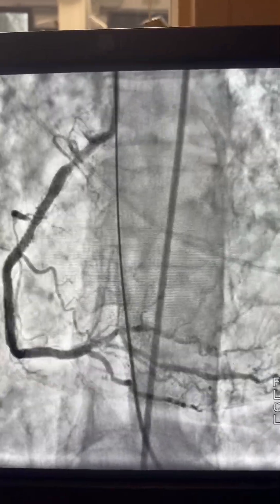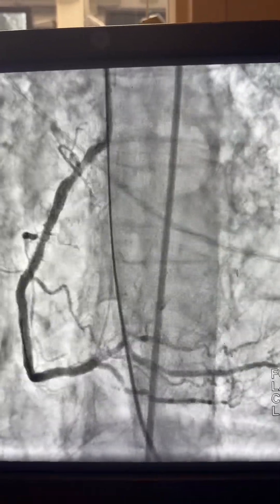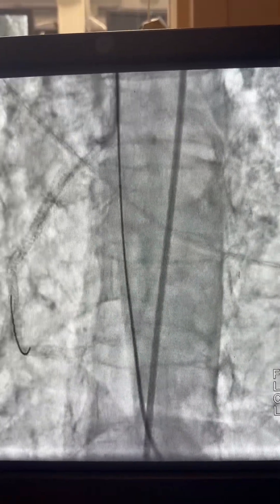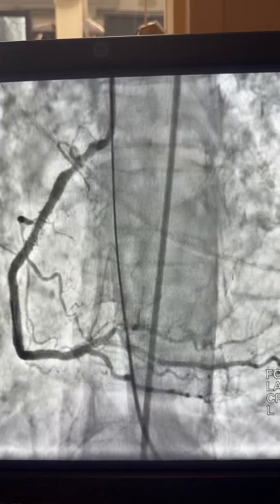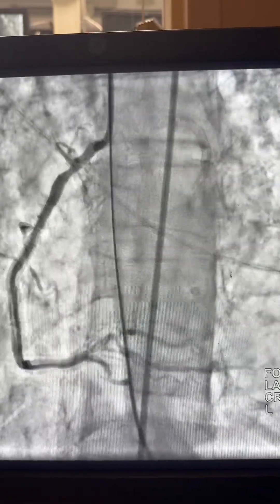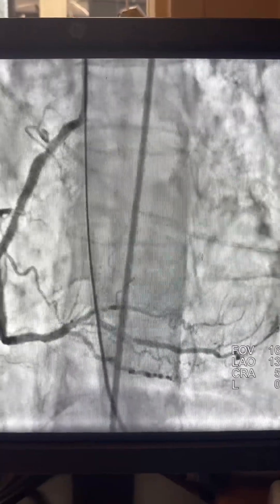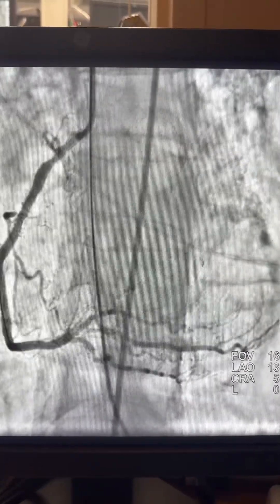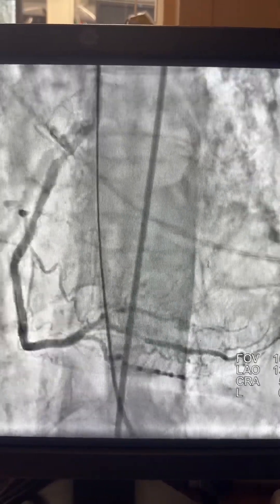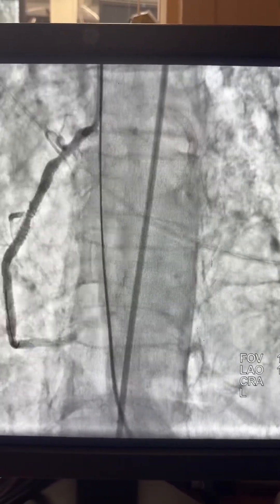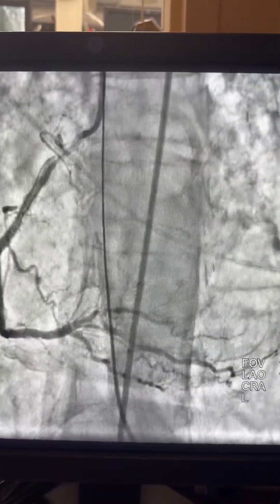To summarize coronary interventions: we've established flow in the left main, distal LAD, LCX, and now the RCA, PDA, and PL branches. We're done with coronary intervention and now moving to place a balloon pump or Impella.